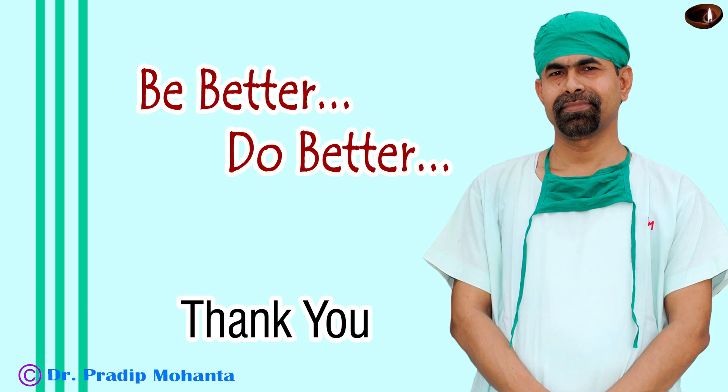Thank you very much for your attention. Hope this video will inspire you to do bevel down faco. But please ensure stability of the anterior chamber, and there should be a sheet of epinucleus covering the posterior capsule — there should not be bare posterior capsule as seen in hyper-mature cataracts. Be a great surgeon and serve your patients with love, respect, compassion, and great surgical competence.